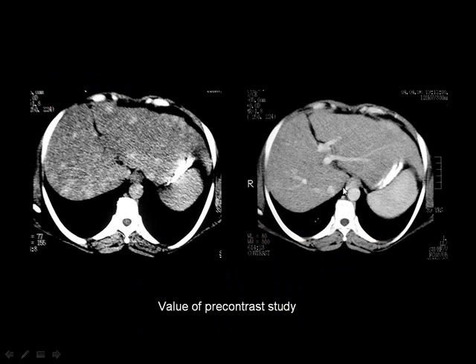These are two cut images in the abdomen, and this is without contrast because the aorta is not stained with contrast. And this is after injection of contrast because the aorta is stained with contrast material. Then in this liver, you cannot see any pathology. But if you go back to the non-contrast image, you can see a lesion here, and another lesion here, another lesion here, another lesion here. What is the reason for this?